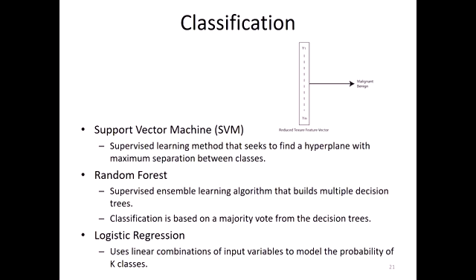And then logistic regression, which is using linear combinations of the variables to predict the probability of k classes. In this case, we have 2 classes. This is tied right in with the elastic net. And it's in the same software package, and so these two kind of go hand in hand.